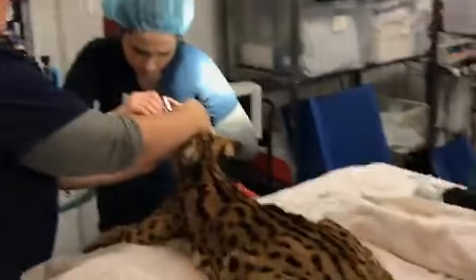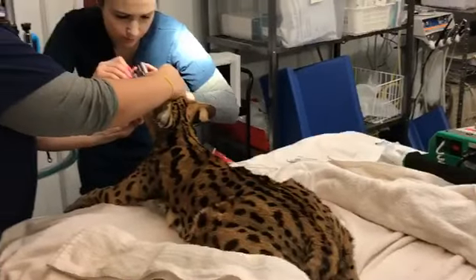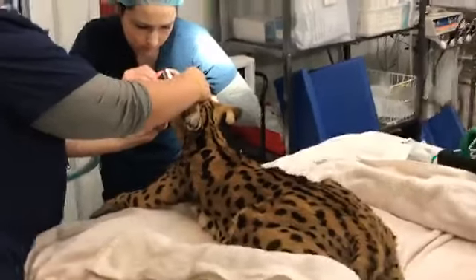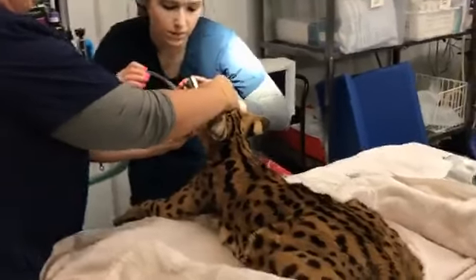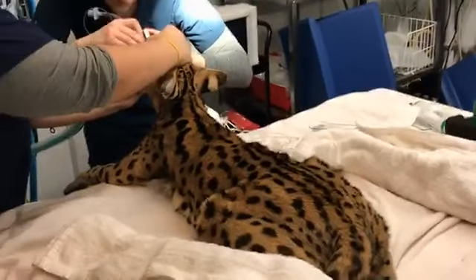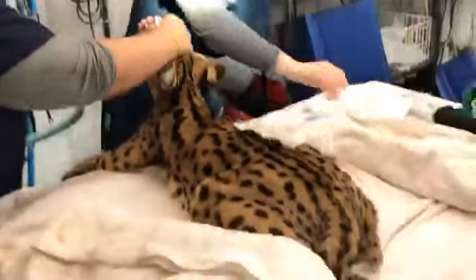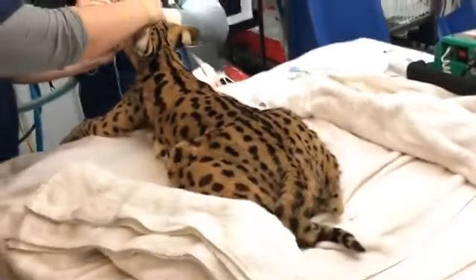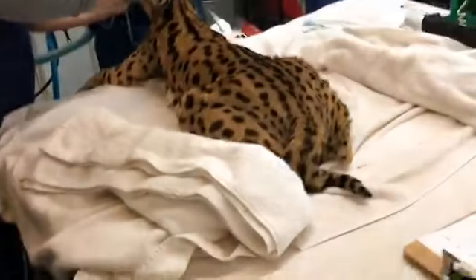We're back live here with Ava, who I keep wanting to call Avocado, maybe. Jensen says, I like to create names for the cats that aren't really there. They're intubating our beautiful girl right now, because we're getting ready for the spay. If you just tuned in, we did check that Ava, sadly, is 4-paw declawed.